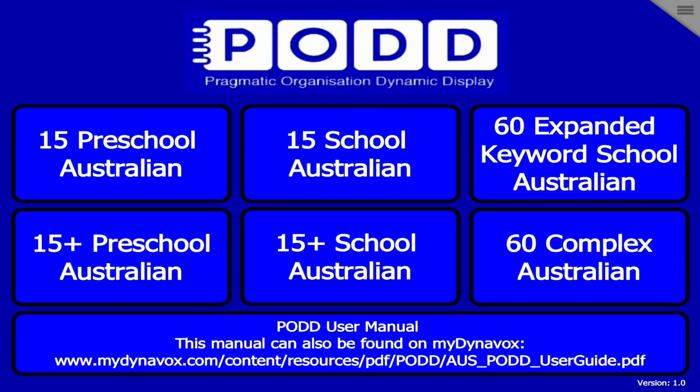And then we have the 15 and 15 plus for school. Again, vocabulary is targeted towards the school age population. So you'll find things around curriculum topics and like science and maths and things like that. And then we have the 60 expanded keyword and 60 complex for more literate users and individuals that are putting sentences together in a more complex fashion.